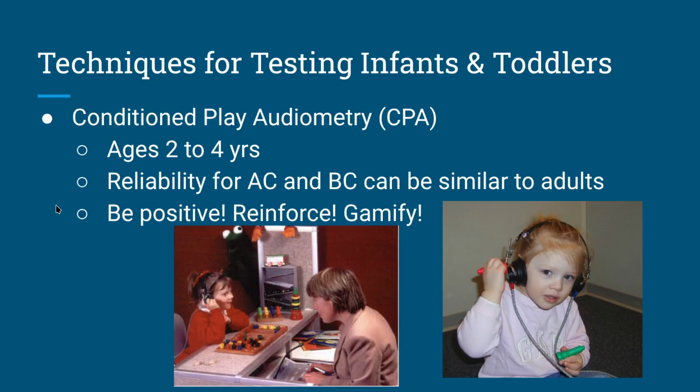An experienced audiologist needs to keep the child engaged and happy, putting rings on a pole, putting blocks in a bucket, flying planes into a hangar, keeping the child active, keeping them engaged to demonstrate a time-locked response with a super-threshold task. Help the child at first, but they need to do it on their own.